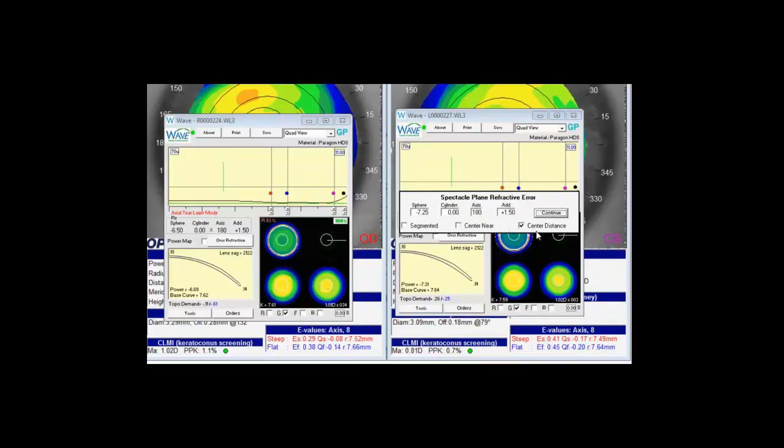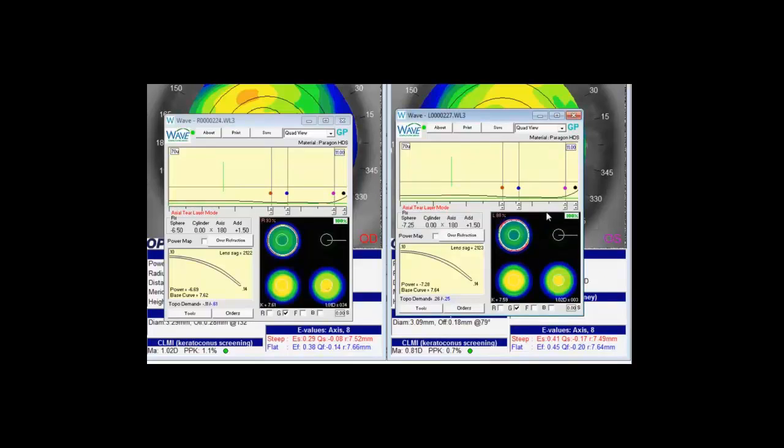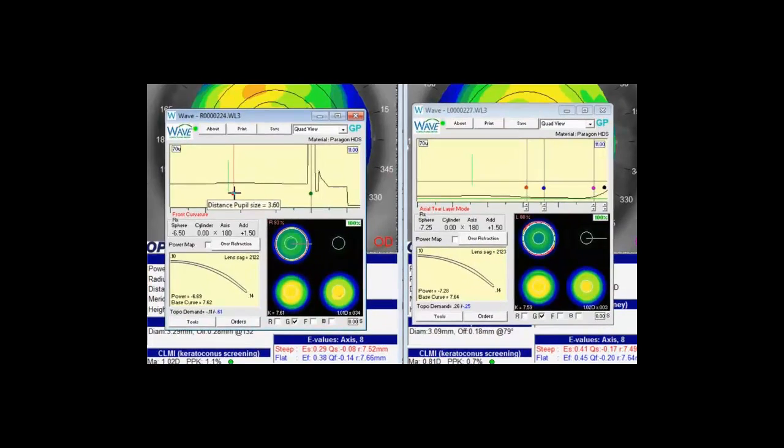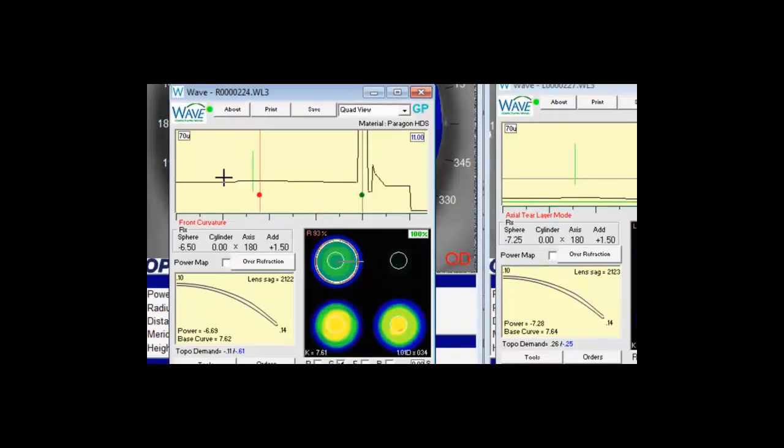Plus 150 defaults to center distance I'm going to stay with that. And next if we come to the front curvature view which is in your quad view is the upper left, you'll notice we have this red control point called the distance pupil size and it's currently set to 3.6 millimeters. You'll also notice this little bump in the curvature line here and that's really where the add power picks up.